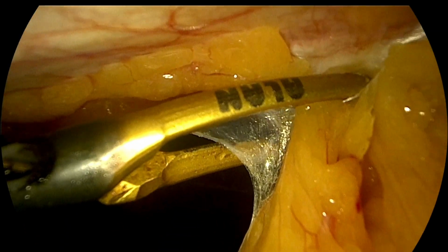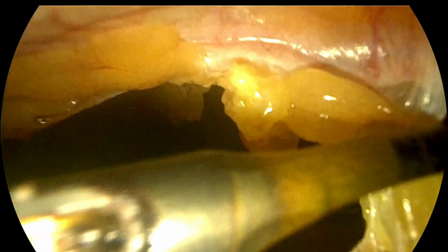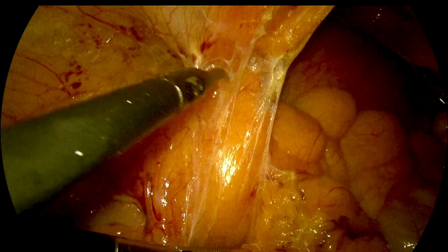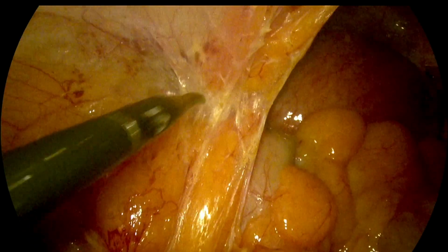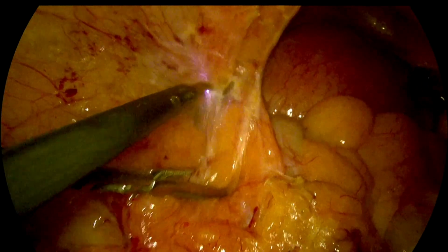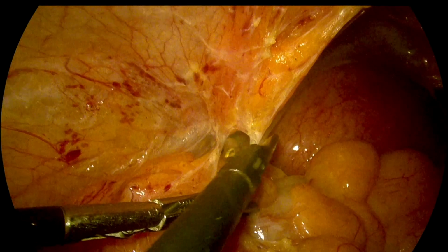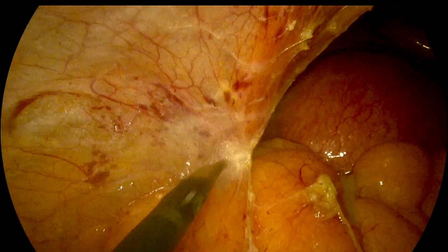So there are some omental adhesions present to the anterior abdominal wall near the umbilicus. It is very near to the primary port. Once we release that, still some more adhesions are anticipated, and they were seen near the left lateral wall of the pelvis. Only after releasing this do we have exposure of the uterus. We can see the uterus now after releasing these adhesions, and there is also some amount of intestinal adhesion to the posterior surface of the uterus.